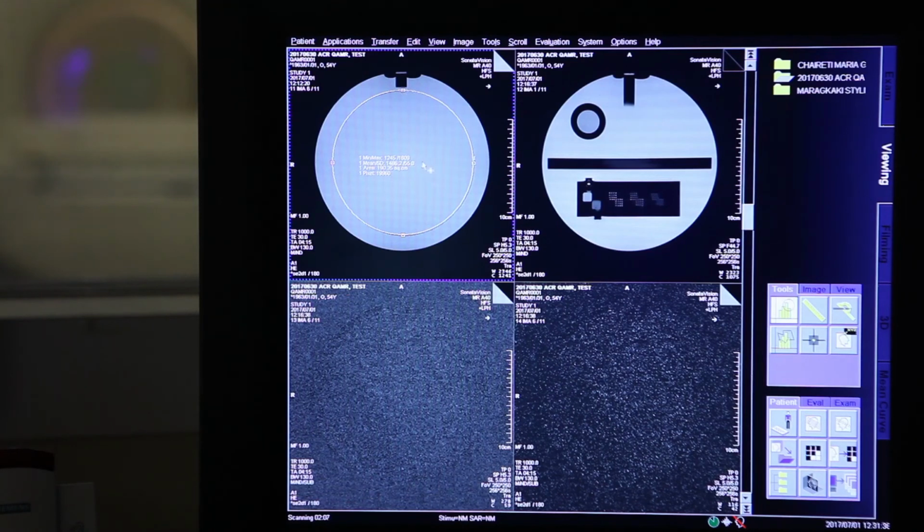Okay. So that's the instruction. What you get in the signal, as you can measure, is 1,486, plus or minus 55. You don't mind about this. Your signal plus background is something like 1400. Then you take this ROI, you copy it, you go here, and you paste it there.